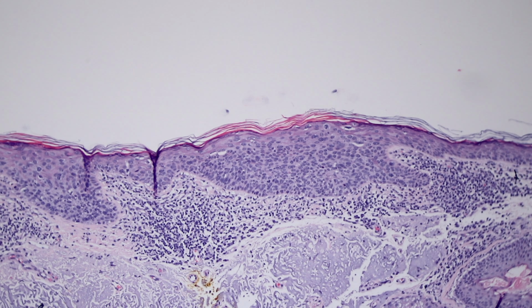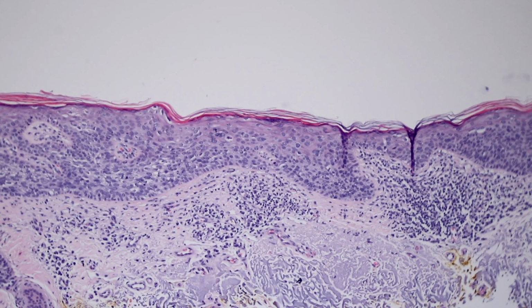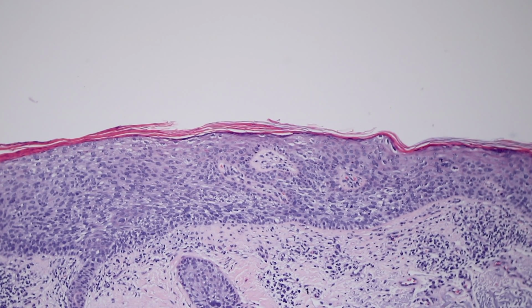Usually basal cell carcinomas do not have full thickness atypia in the epidermis, but I have seen cases that did, and I've seen cases of basal cell carcinoma that had a little bit of pagetoid spread. So that alone doesn't totally tell you the difference, but usually if I see full thickness atypia and pagetoid spread, and I don't see good basal palisading, I tend to think it's going to be a squamous cell carcinoma in situ rather than a superficial basal.